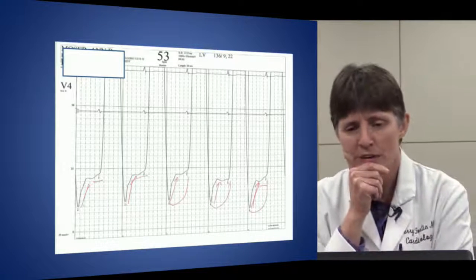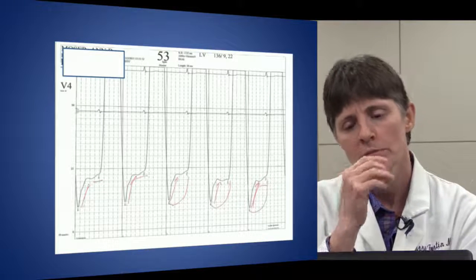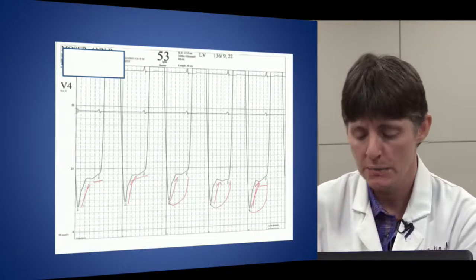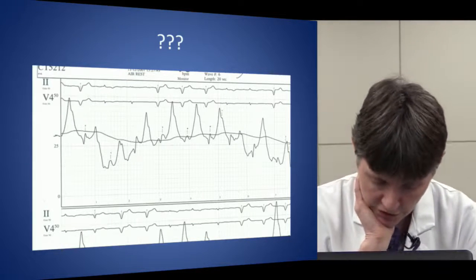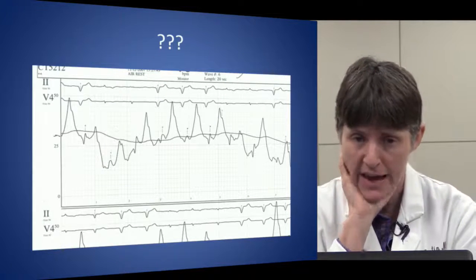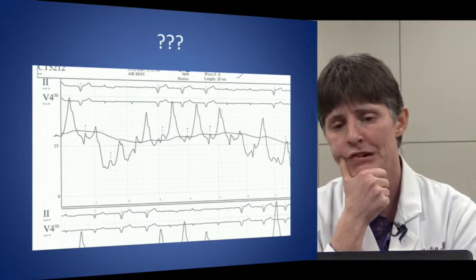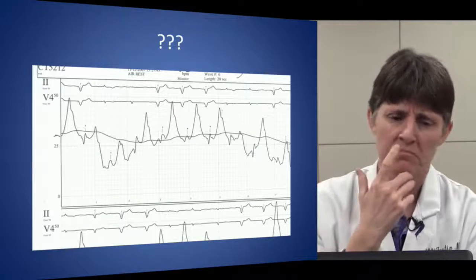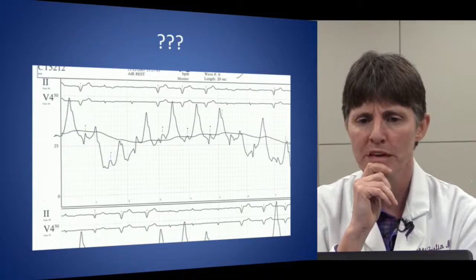Again, an LV EDP, as we saw some of those RV EDPs, where there's a rapid upstroke, just not normally reacting. Those red lines on there are what it should normally look like at the bottom. This is a little bit harder. So this is advanced. This is a wedge tracing, I'm going to tell you that. I think you could look at those middle several beats and say, it's kind of a triangular beat. It looks more like a PA tracing, and the height of it wouldn't be terribly off for a PA tracing, but it's a wedge, and we know that because if you time it.